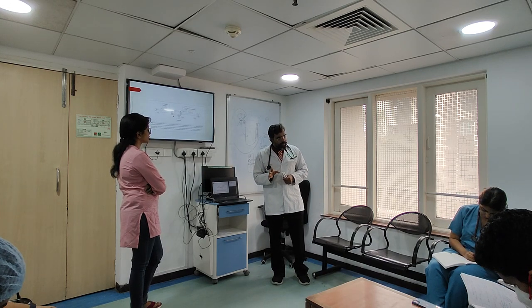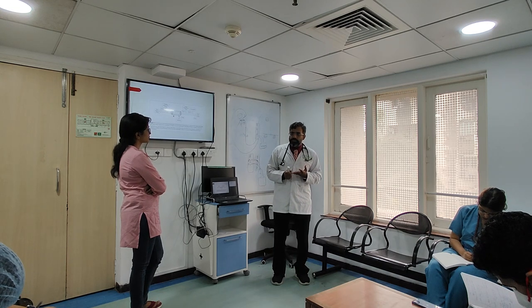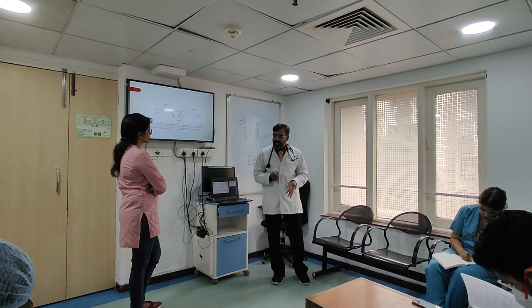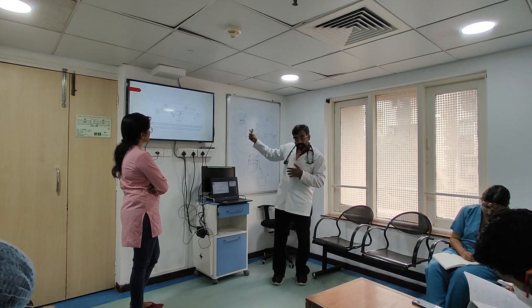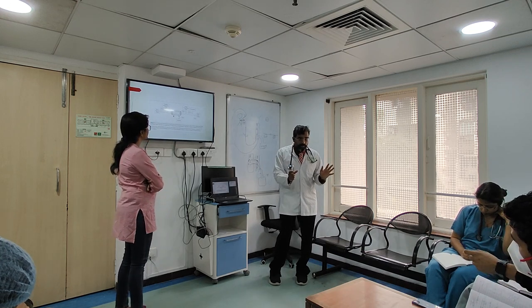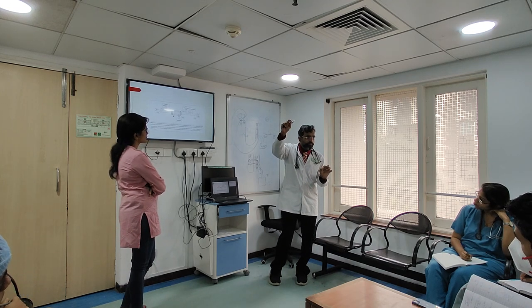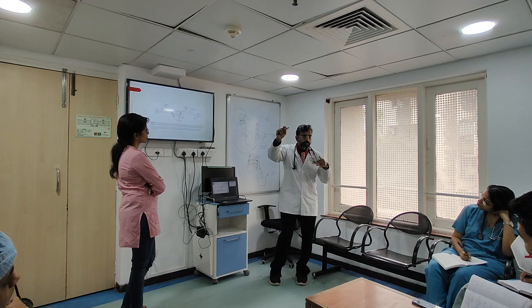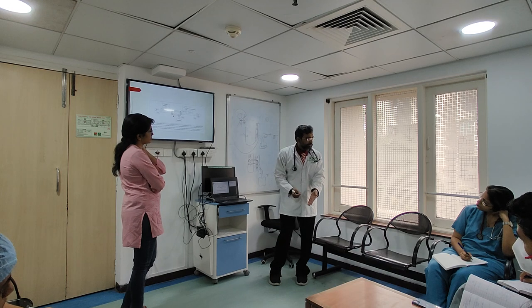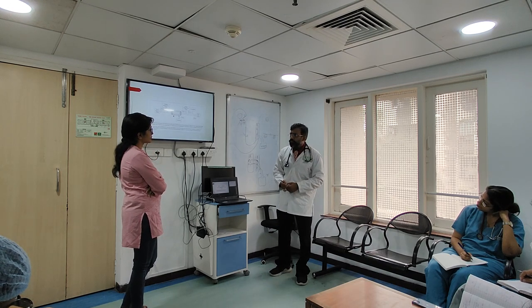Pre-filter. Clear on this? Even if I am giving post-filter, my flow is going to increase only. It's all going to go into the blood only after all. But the clotting effect is normally here. That's why when you see your machine diagram, when you see the cassette they are going to put inside, there will be one port here, one port on top. The first port is just before the filter, where I tell the nurses to put normal saline, attach it over there, because I am helping the clot not to occur.